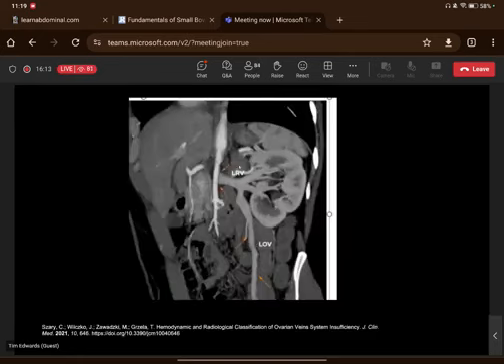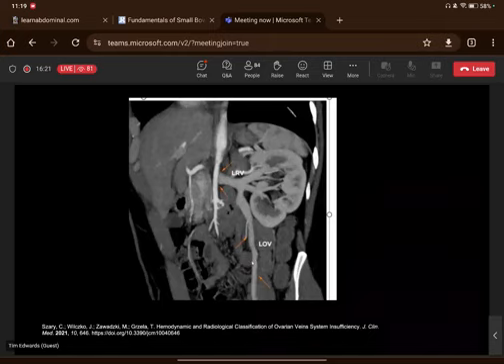As we mentioned, I'm just including an image here to show. We've got a few more images, and Bhavna goes into it a little bit as well. I remember seeing in practice questions some images that would show a relatively large caliber vessel running from the pelvis, draining into a relatively large caliber renal vessel.